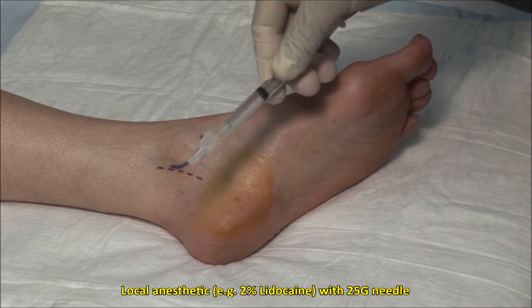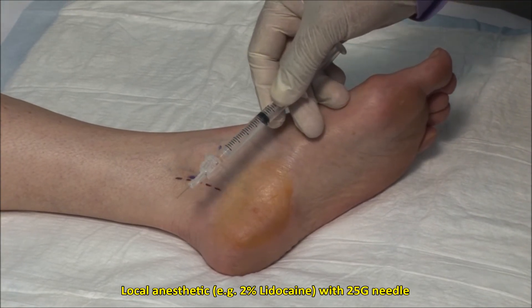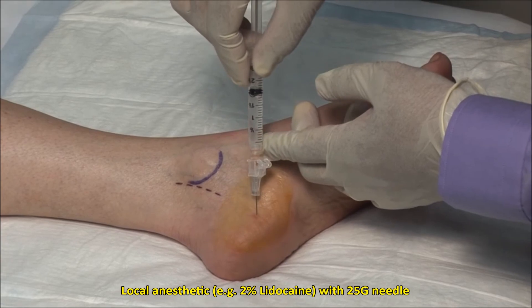Using a 22 gauge, 5/8 inch needle, apply local anesthetic to the skin and subcutaneous tissue.